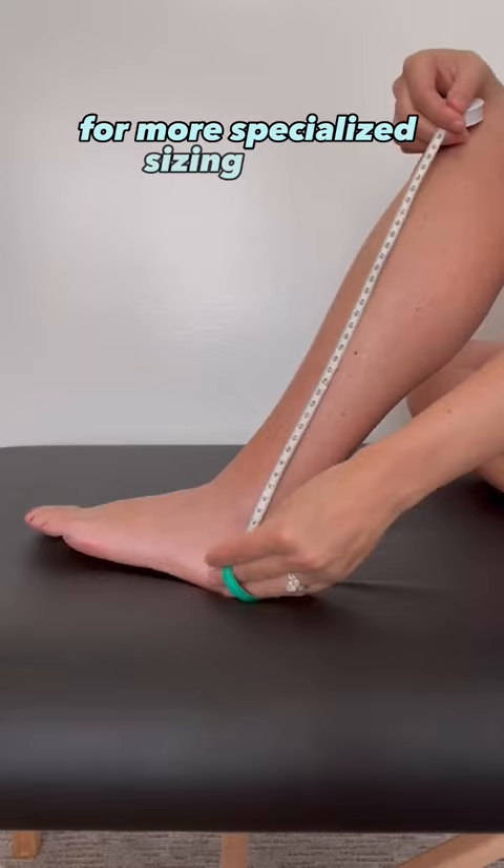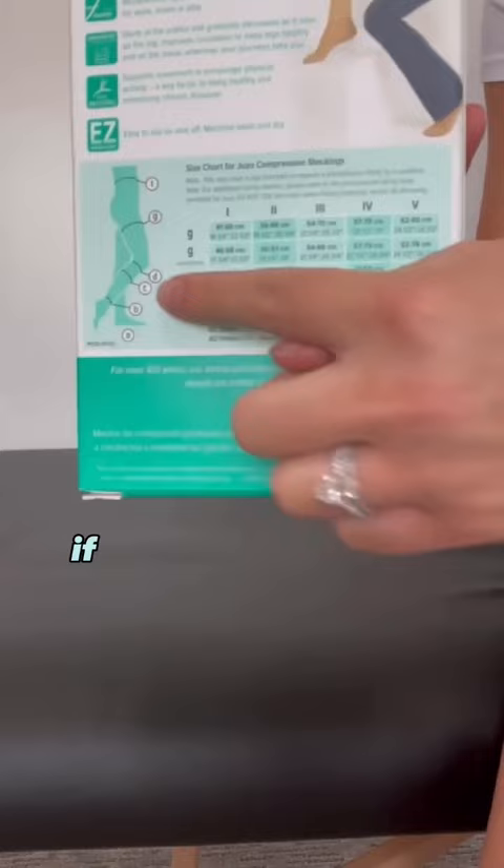Then, using the guide, look for what size you'd fit into. If you're in between sizes, make sure to size up.